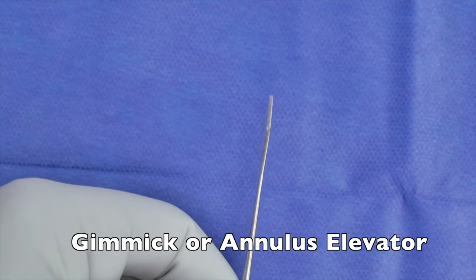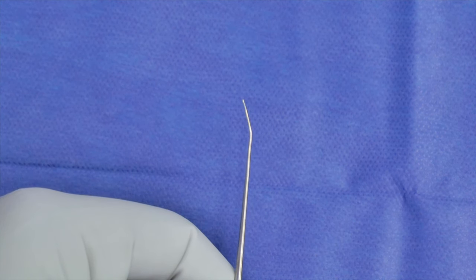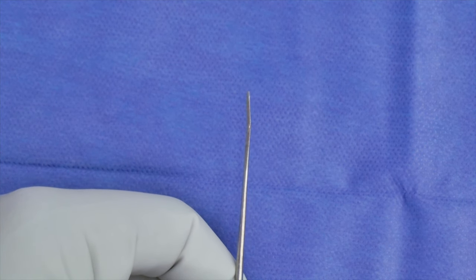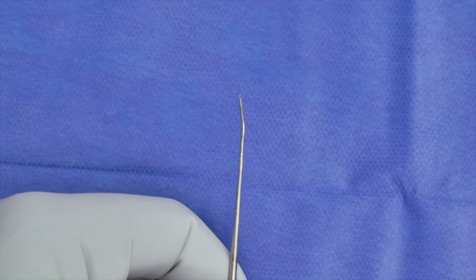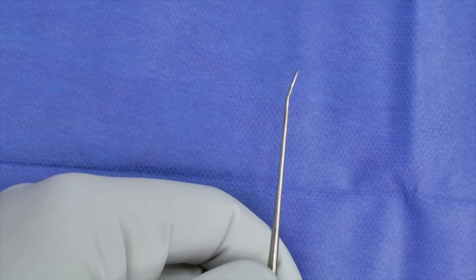Here is a gimmick. The gimmick is also called the annulus elevator, and it's most commonly used after you've raised your tympanomeatal flap to deliver your annulus from your annular sulcus. You're able to slip it in by the annulus and elevate up inferiorly quite efficiently when you're raising your tympanomeatal flap.